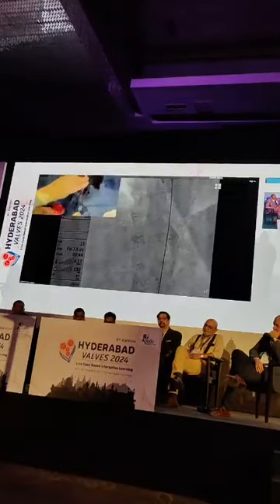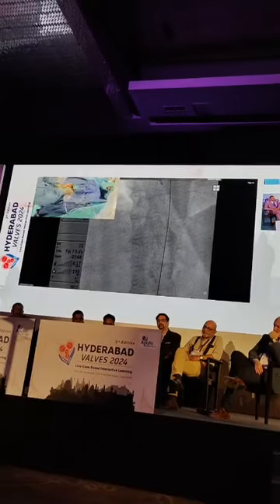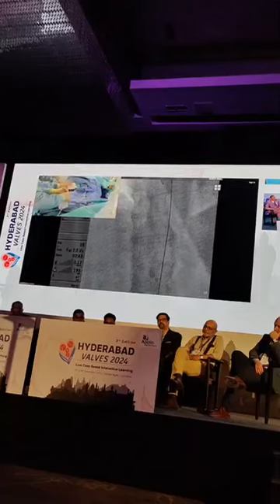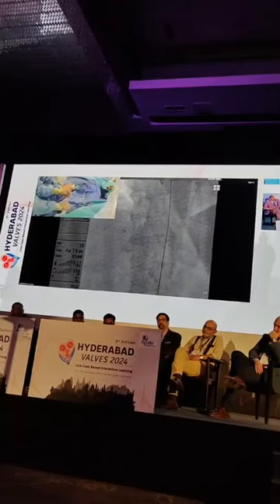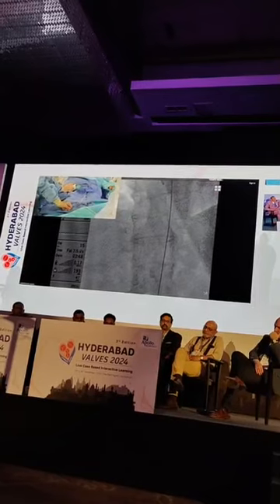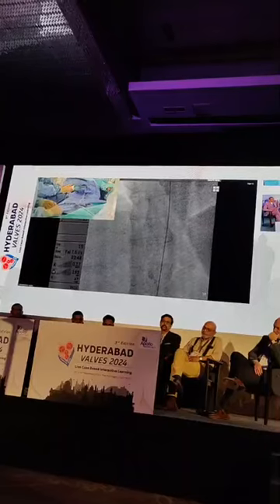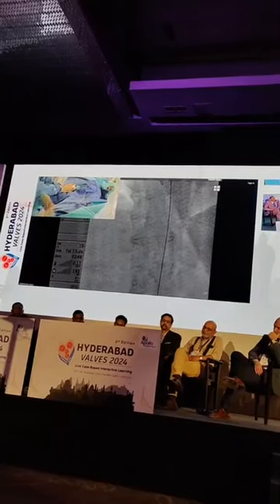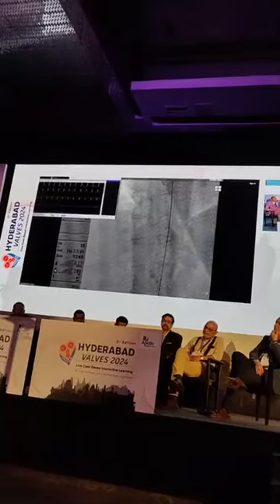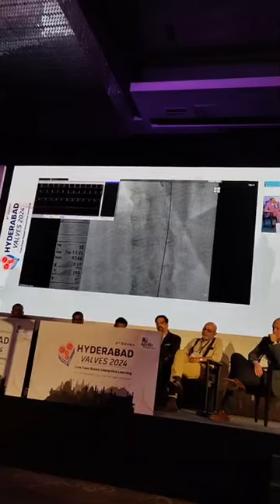Christophe will pull back the dilator, and we will advance the 14 French sheath, which is expandable because it will increase in diameter once we introduce the delivery catheter. So the patient is doing very well. She's on local anesthesia. We did mild sedation because it was a little long for her to wait. We have to place the sheath.